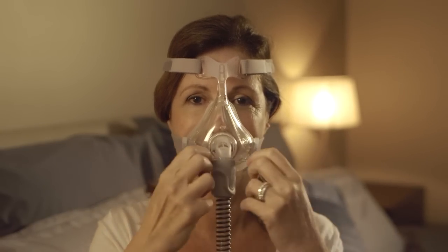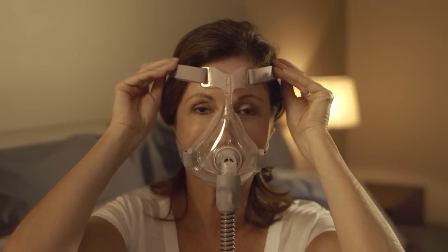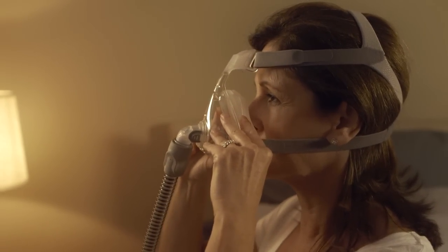If you feel any air leaking out of your mask when the machine is blowing air, readjust the bottom tabs evenly and then finally the top tabs. If air still leaks, simply reseal the mask by taking the cushion off your face, then reapplying it until it seals properly.